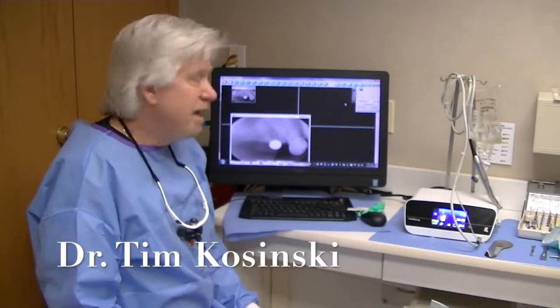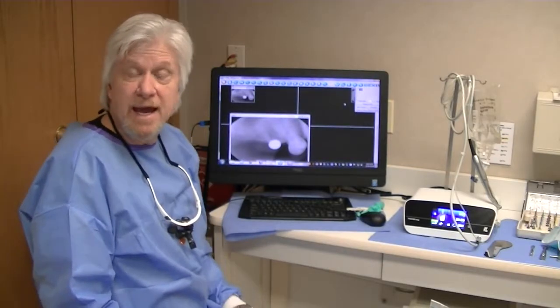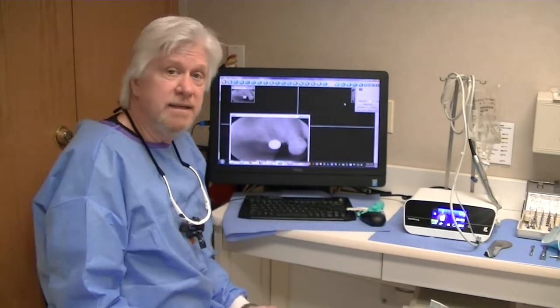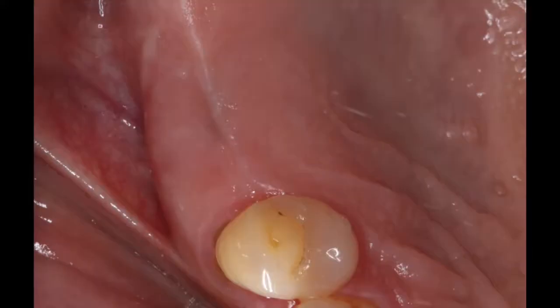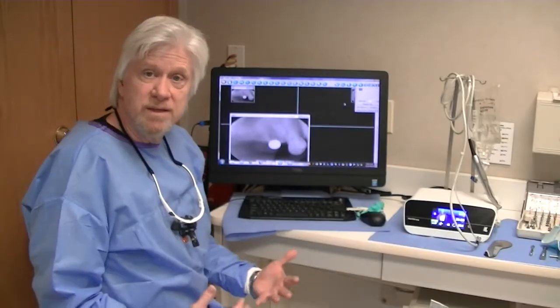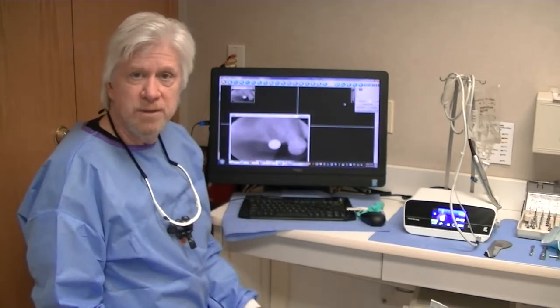Hi, I'm Dr. Tim Kosinski, and today we are going to demonstrate the protocol for placing a Hahn dental implant in the edentulous maxillary right second bicuspid area. I want to go through the entire process to make you more efficient and proficient in your implant placement.